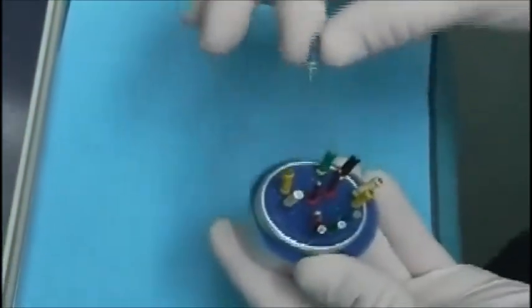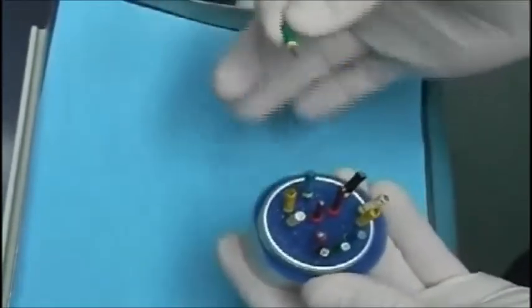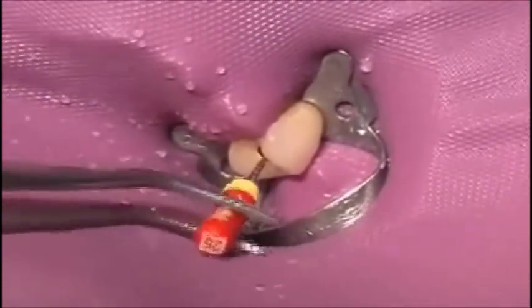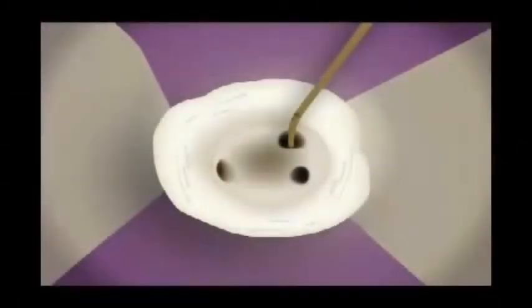With the aid of sterile instruments, the dentist can begin to clear and clean the interior of the tooth. Special solutions are used intermittently for rinsing in order to remove tooth chips, cell debris, and bacteria. It's important that all canals are reconditioned. Most teeth have several canals. 3 of them are shown in this image, and the instrument is placed in one of them.